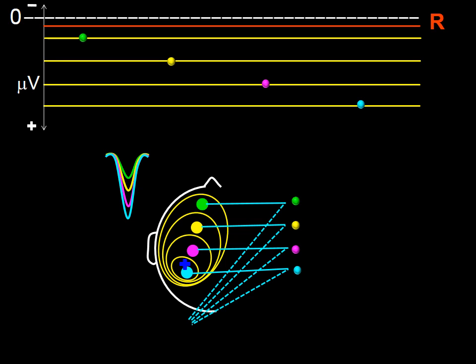Notice that the input 1 comes from the scalp, whereas in this case I am representing input 2 as a non-cephalic reference. This electrode is acting as the common reference electrode.